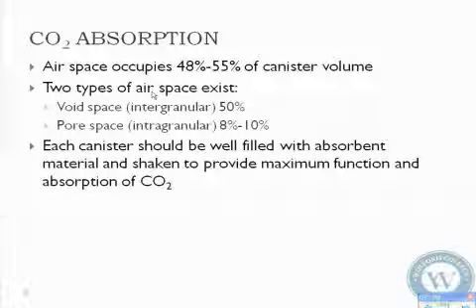All right, the airspace is about 50% total volume. Two types of airspace: the void and the pore space. The void space is everything in between the granules, and the pore space is actually in the granules itself. And the last statement is just, as you replace it, shake it up. All right, so shake it and then put it in.